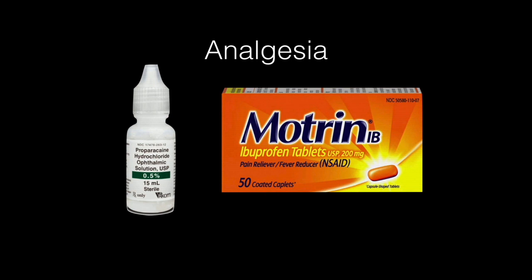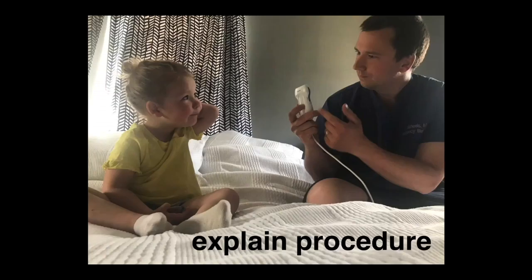And of course, if the patient's in a lot of pain, anything you need to do, Motrin or something a little bit stronger to help get the patient more comfortable for your exam. And then what's really important, I think, is actually explaining the procedure to your patient. Here I am describing to Evelyn what she needs to do for this procedure, but really it's quite simple.